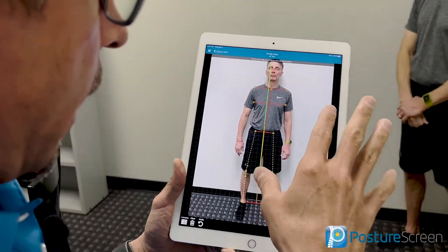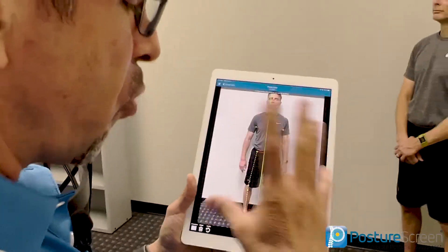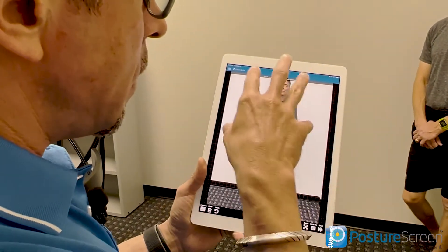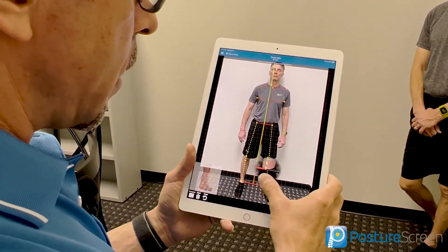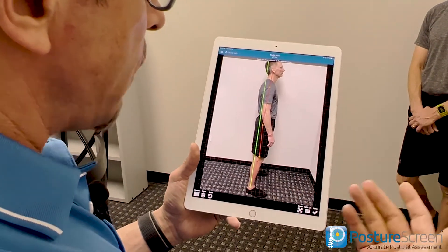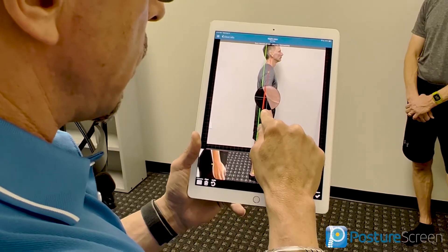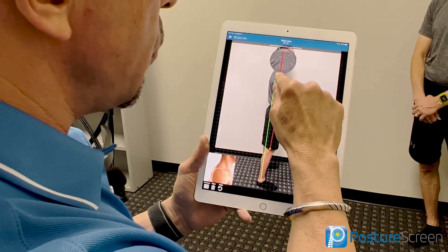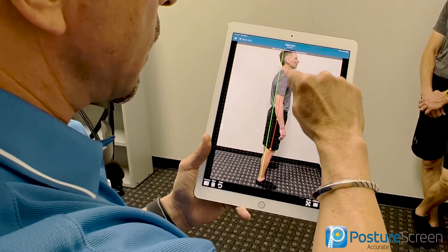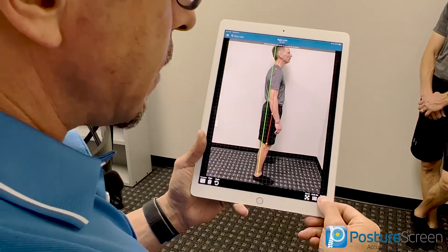At this point, if you see the computer made a mistake — and a lot of times when it makes a mistake it's usually due to clothing or poor lighting — you can drag a point and go ahead and fix it. At this stage, you can fix anything that you need to. We're going to go ahead and hit Next. Notice it did a fabulous job even on an old device. One point I'd like to fix: I'm going to move this more to the greater trochanter, move this point up a little bit more, and bring this point down just a little bit more, so that line follows approximation of their neck. And at that point, we're all done.